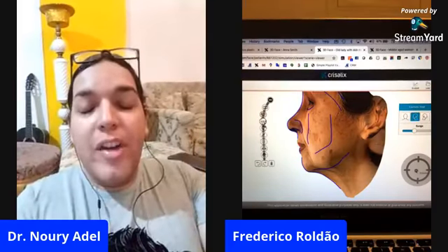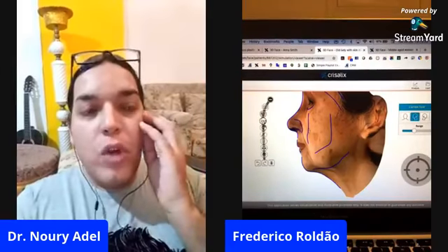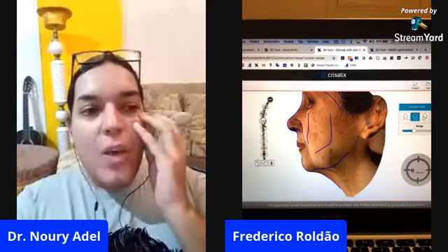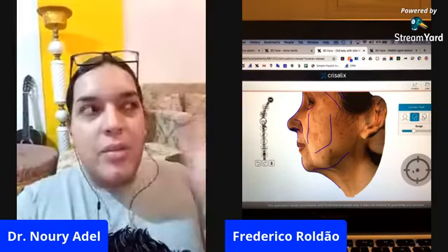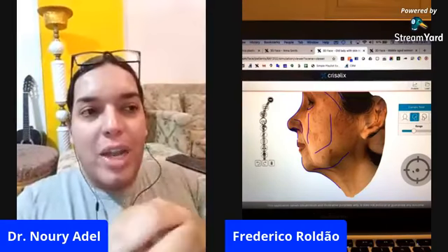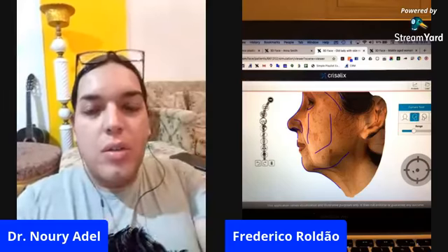Frederico, I want to ask you now about adding some volume. When you add volume for the cheeks, how can you estimate how much filling material you need? I mean, how can you transfer the data from the software to your clinical practice to estimate how much volume I need to give this result?